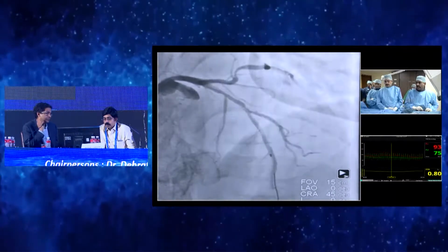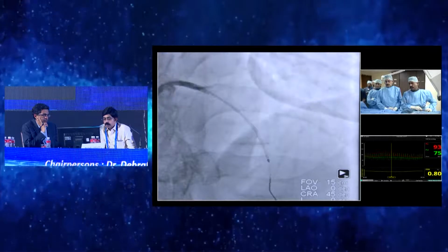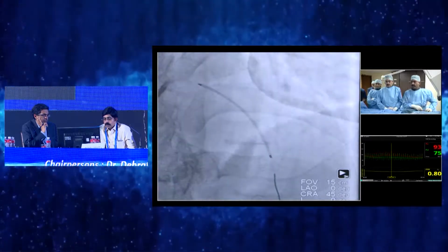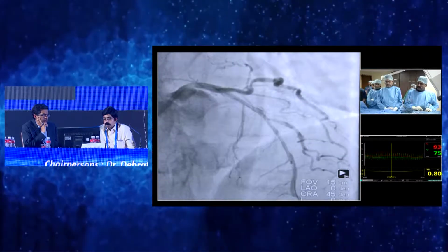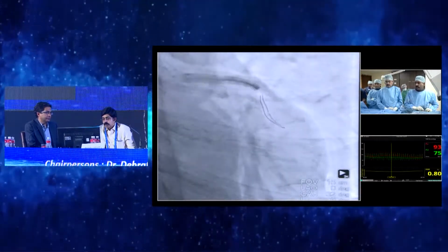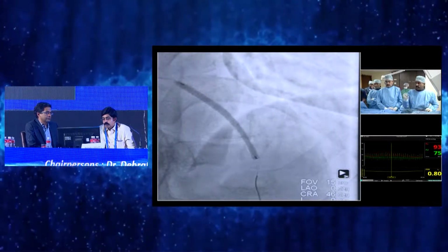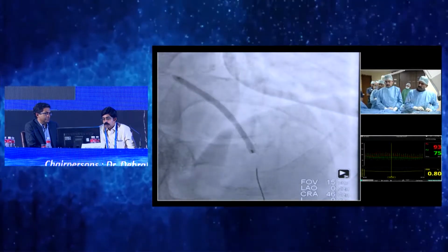The lesion length which we calculated came to about 45. We took a 3 by 48 stent. This is the Xience Expedition stent which we placed exactly. It suited, we felt, and then we went ahead. It's important to check the proximal location in the caudal view again. We thought it is fine. Then, because the distal vessel streamed a little less, we went up to nominal 12 atmospheres there.